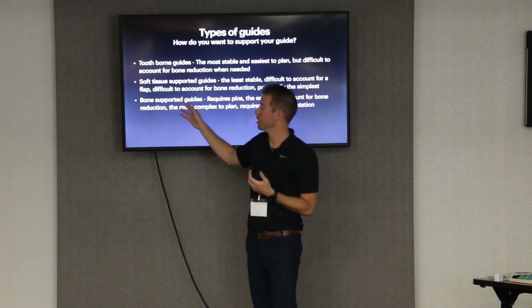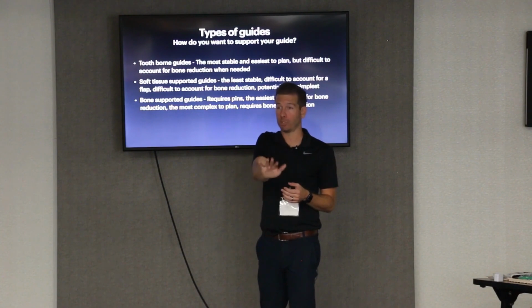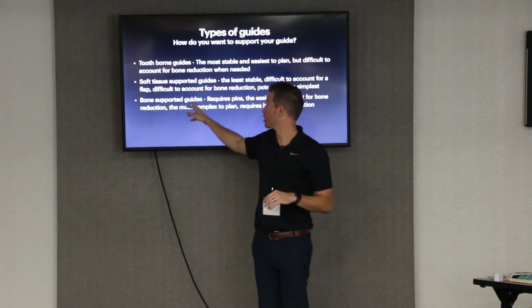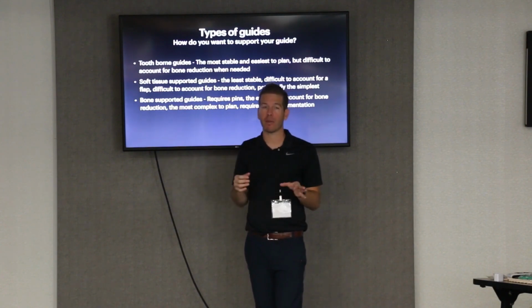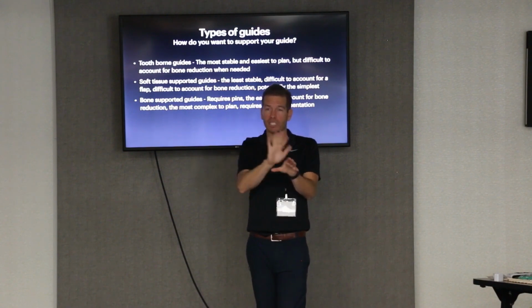And then the third is bone-supported guide, where a guide is actually literally laying on a jaw. So you have them fully flapped open. That would be like what a bone reduction guide is. So a bone reduction guide would actually be pinned up against the jaw, and it's actually resting on the jaw.